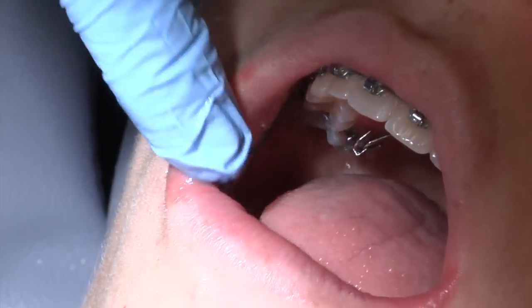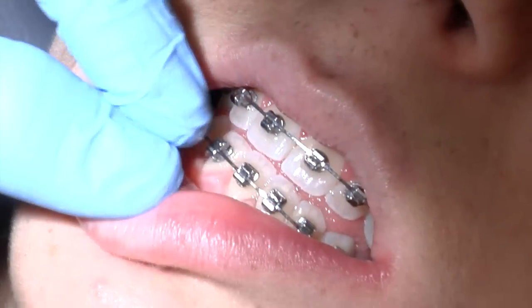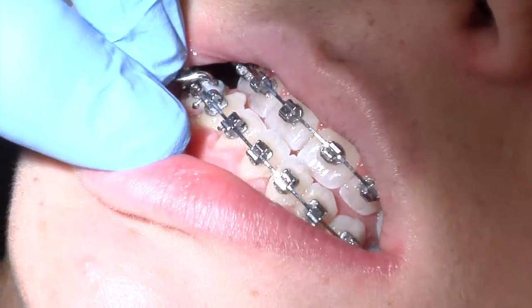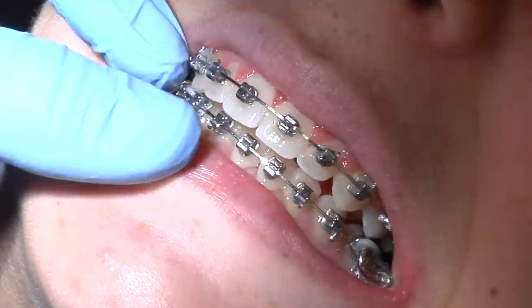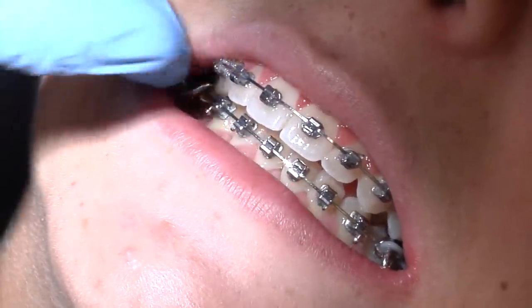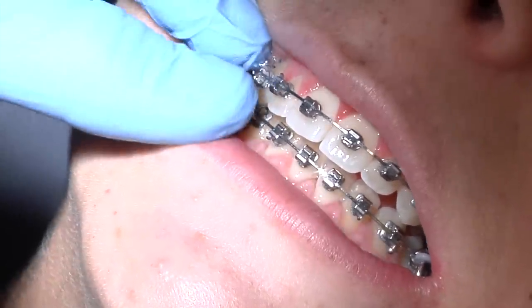It's important to check your bite daily. Your bite is over-corrected when you have an edge-to-edge bite or when your bottom teeth are overlapping the top. This is not an ideal bite and the appliance has over-corrected itself. To ensure that you don't get to this point, carefully bite down on your back teeth in a normal, comfortable biting position. The top teeth should always overlap the bottom teeth.